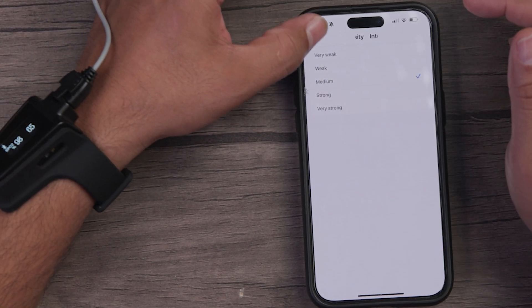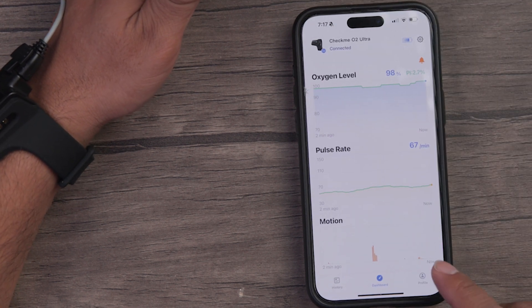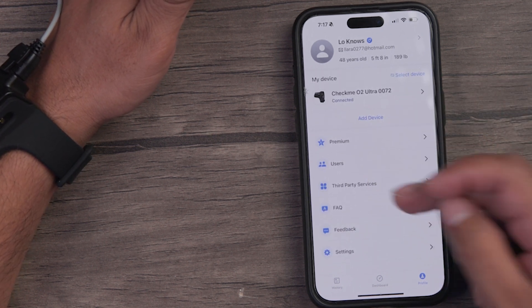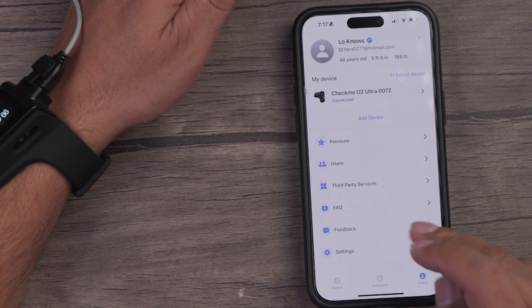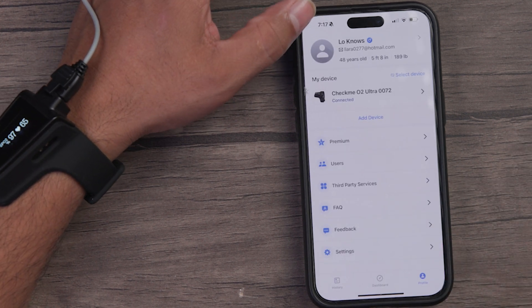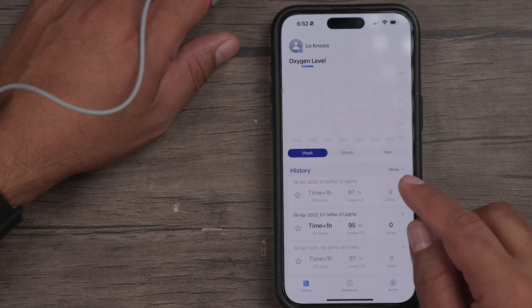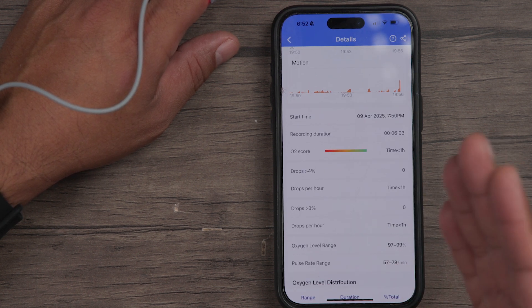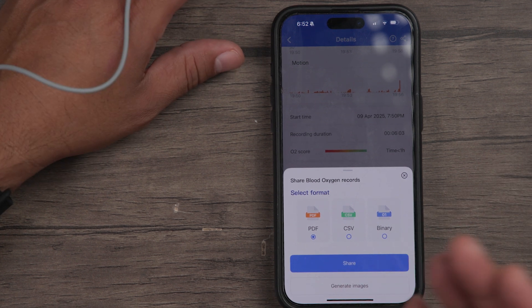We'll put it back on medium. You have other customizations within the app, and you can check out your profile, go to a premium account if you like, and connect to third-party services like Apple Health or iFit. If you press the history tab and select one of those entries, it gives a more detailed overview of your stats. If you want to share your data, press the share button and you can send a PDF, CSV, or binary file to a health professional or keep it for yourself.